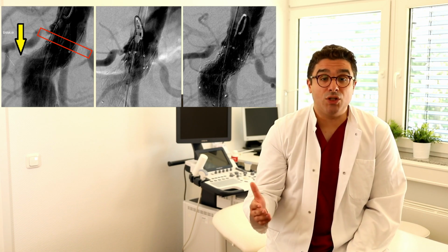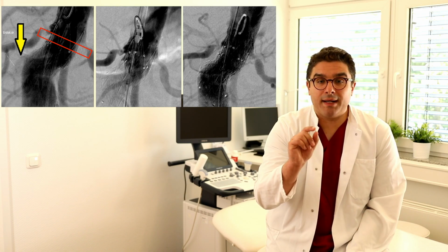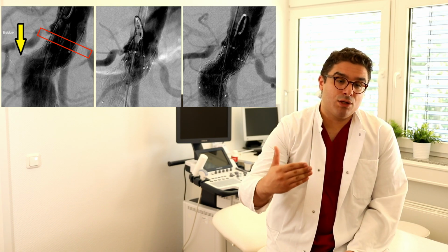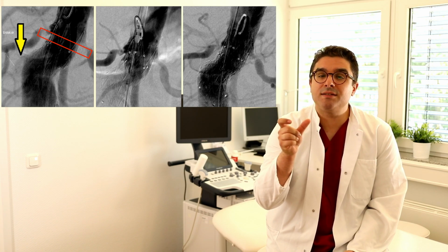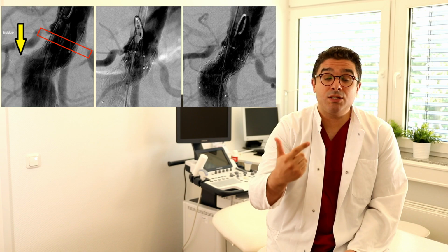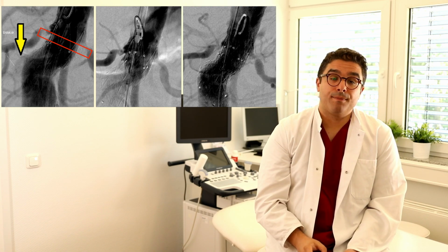You see, there is no type 1a endoleak in the intraoperative angiography. Keep in mind that after the implantation of the main body, the angulated proximal neck has been straightened a little bit, and by this way you can implant more precisely your cuff.